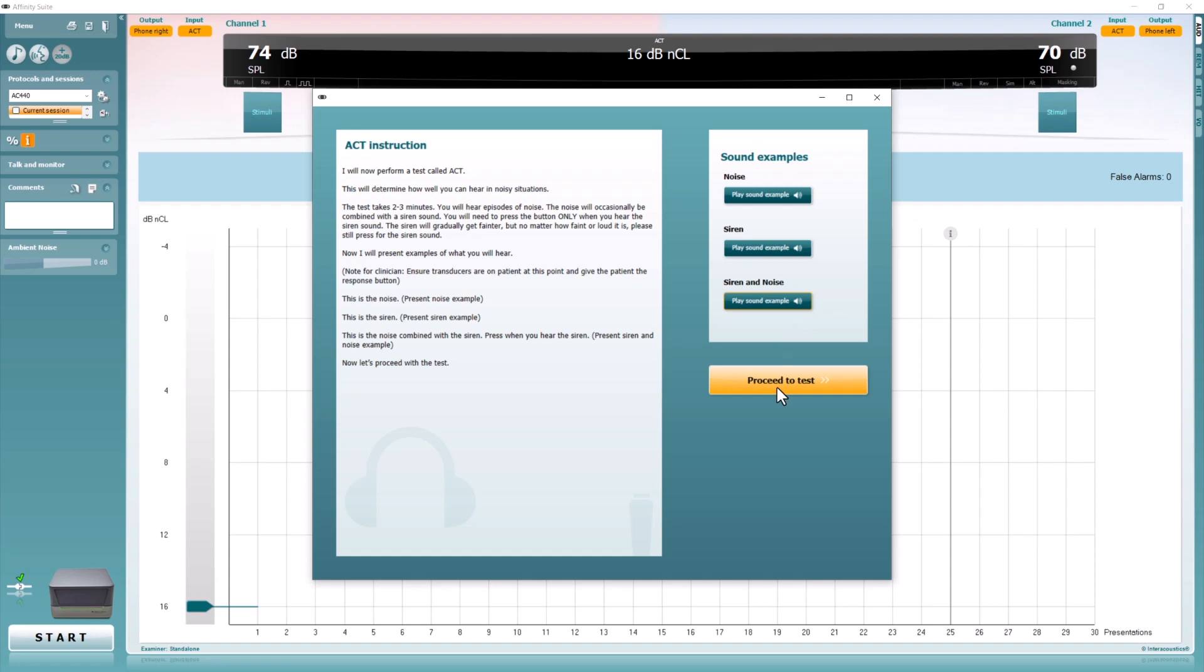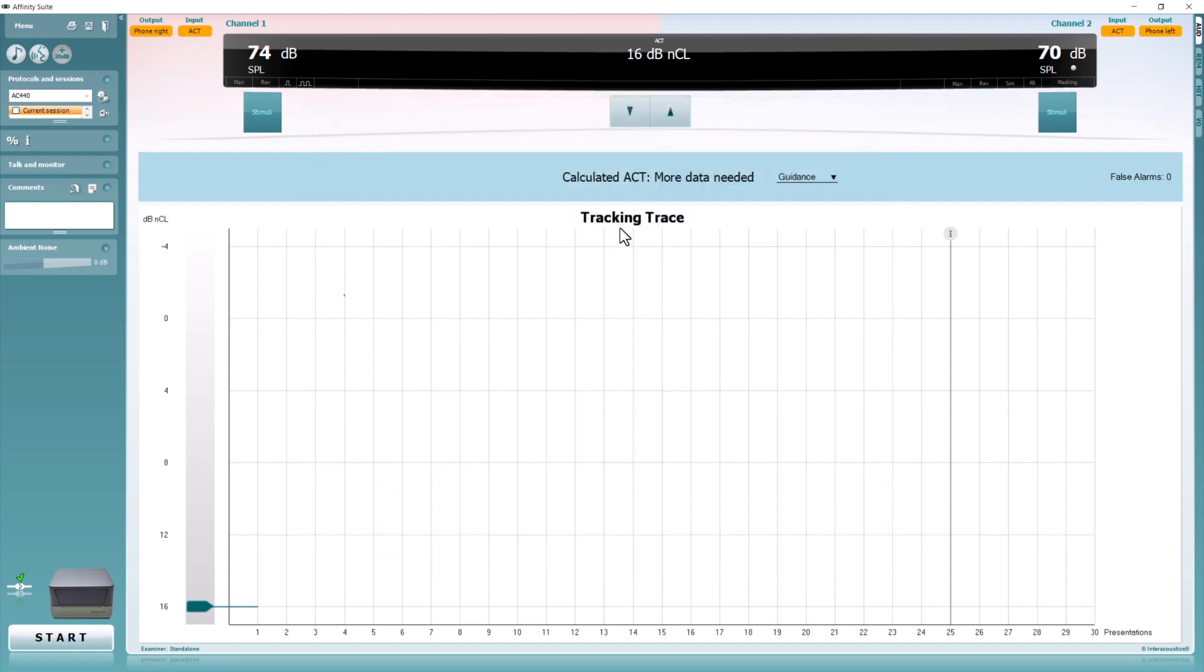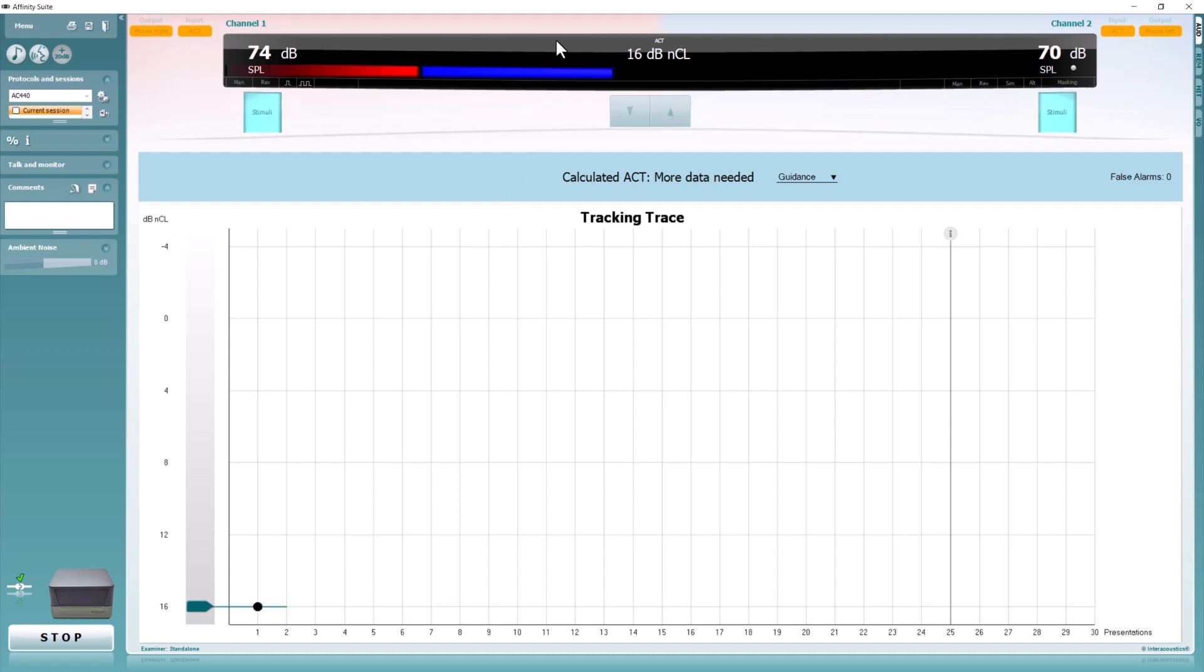Once your client is ready, click Proceed to Test and press Start. As soon as you press Start, your client will hear episodes of noise. The test starts at 16 dB NCL. Press only once to deliver the siren at this intensity. If the client hears the siren correctly, a black dot will automatically appear on the trace.